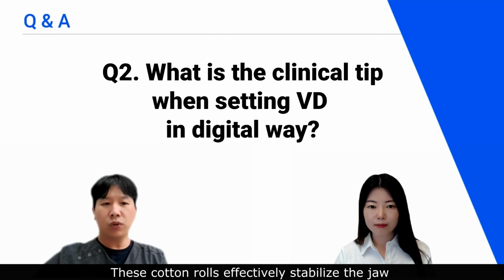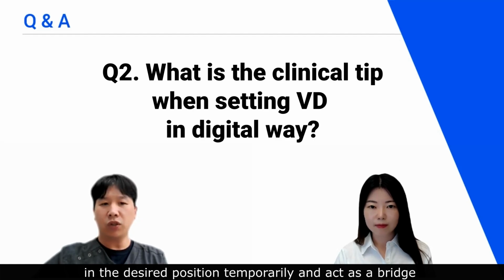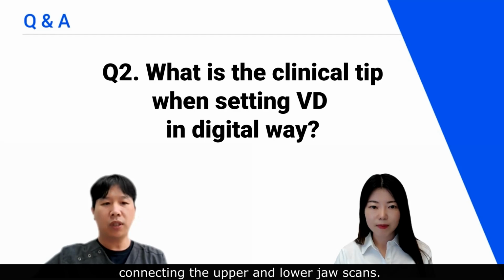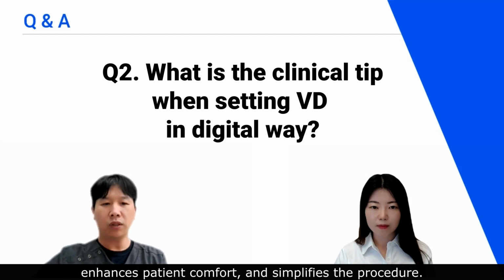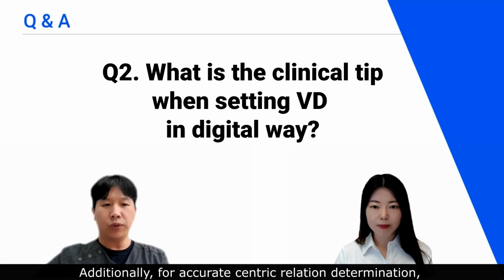These cotton rolls effectively stabilize the jaw in the desired position temporarily and act as a bridge connecting the upper and lower jaw scans. This method facilitates the measurement process without specialized equipment, enhances patient comfort, and simplifies the procedure.